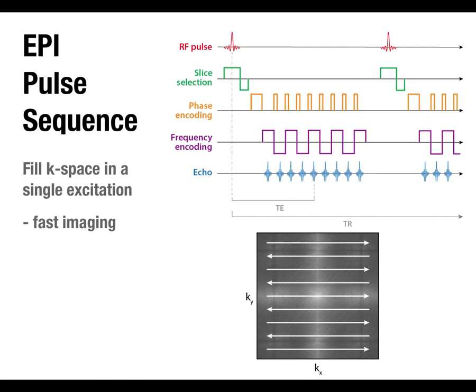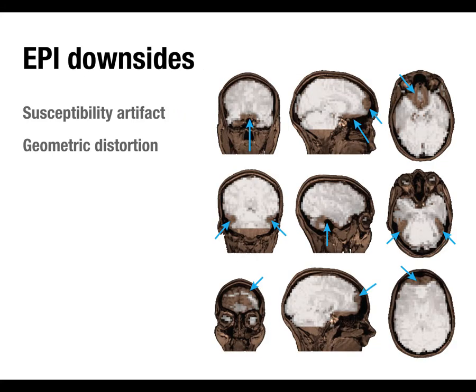Now the advantage in the structural one, and the reason we don't use EPI for structural imaging, is that the structural imaging gives you much better signal-to-noise ratio, better contrast to noise, which means that the white matter, gray matter, all that is much clearer. EPI images look much more fuzzy. They're not good for structure. They're just good at picking up this T2 star kind of contrast.